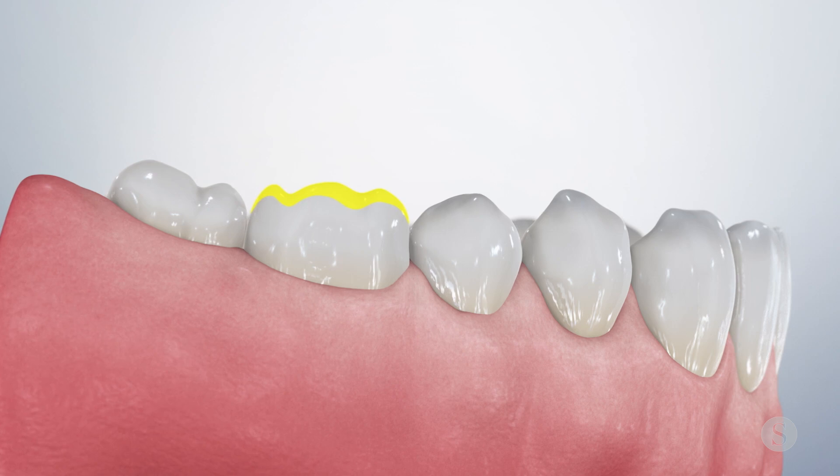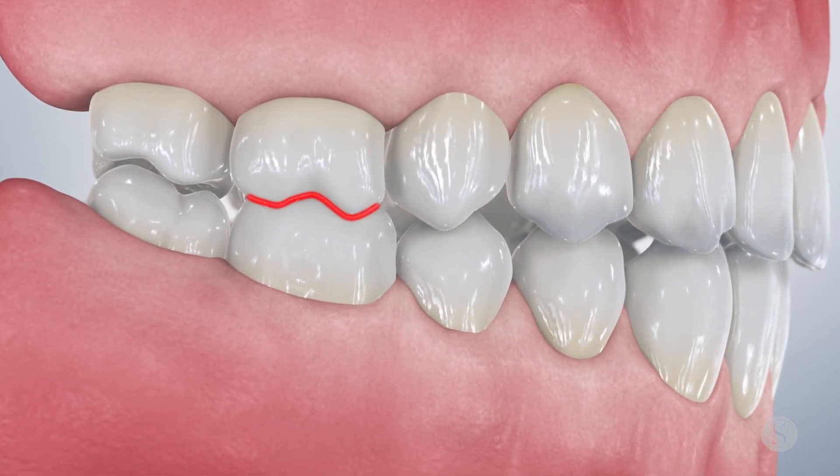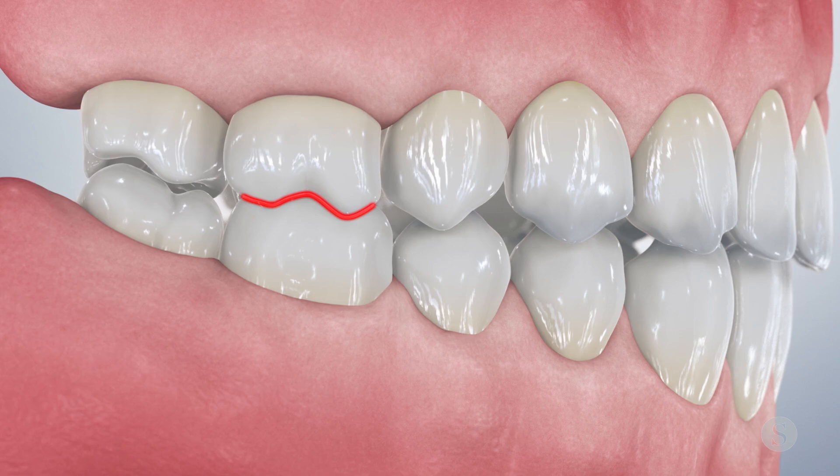When the crown is high in occlusion, it could be due to defective impressions of the opposing arch or an unstable intercuspation that led to inaccurate mounting.